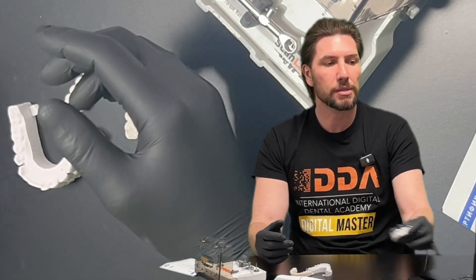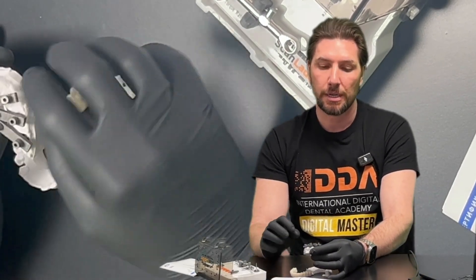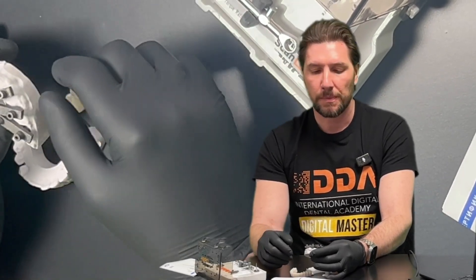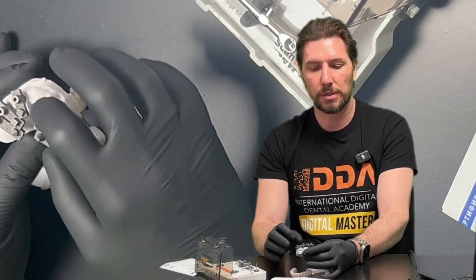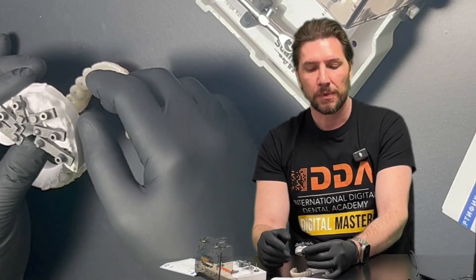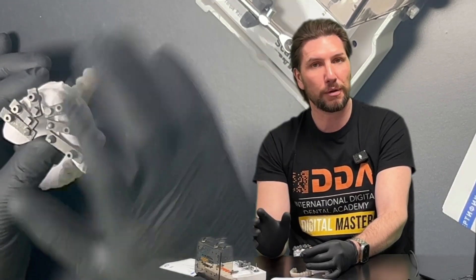The next tip is to make sure you keep the AI feature turned off when scanning. If you're running the scanner with an AI feature, what can sometimes happen is it can mistakenly reproduce anatomy from the scan bodies or the soft tissue and distort the overall image. So we want to turn off the AI so that the scanner picks up those frames perfectly and so that you don't lose track during the scan.